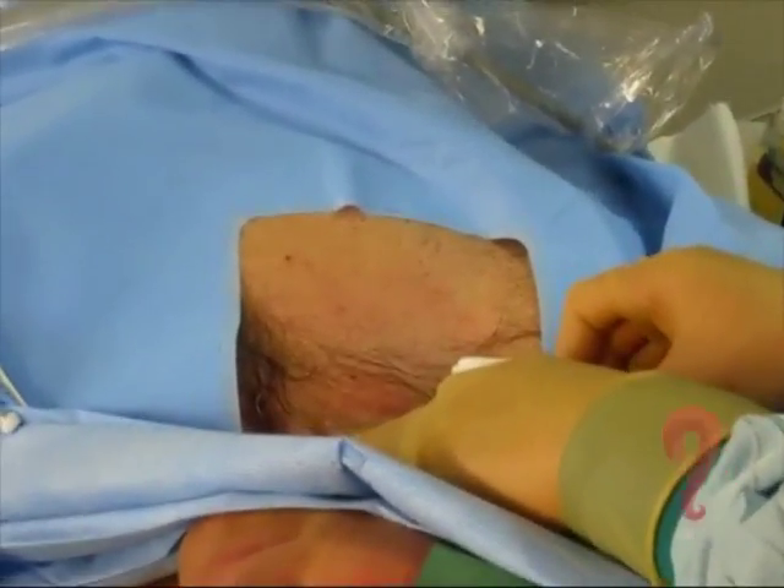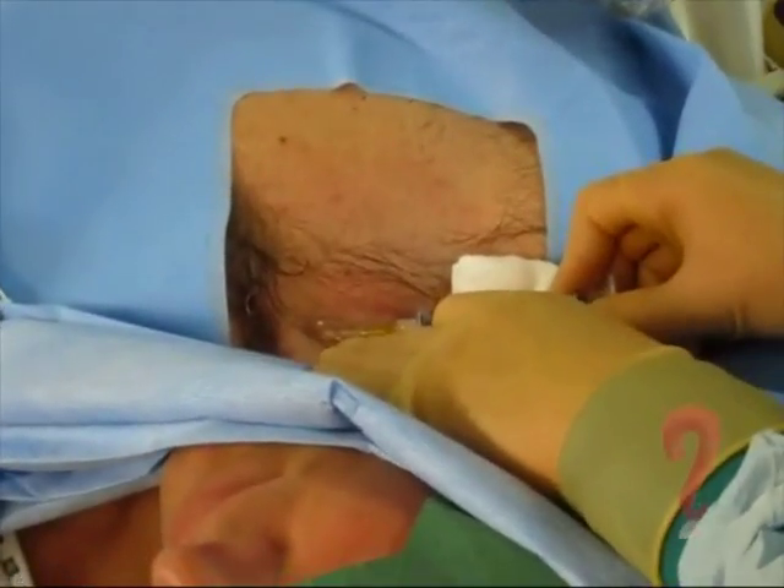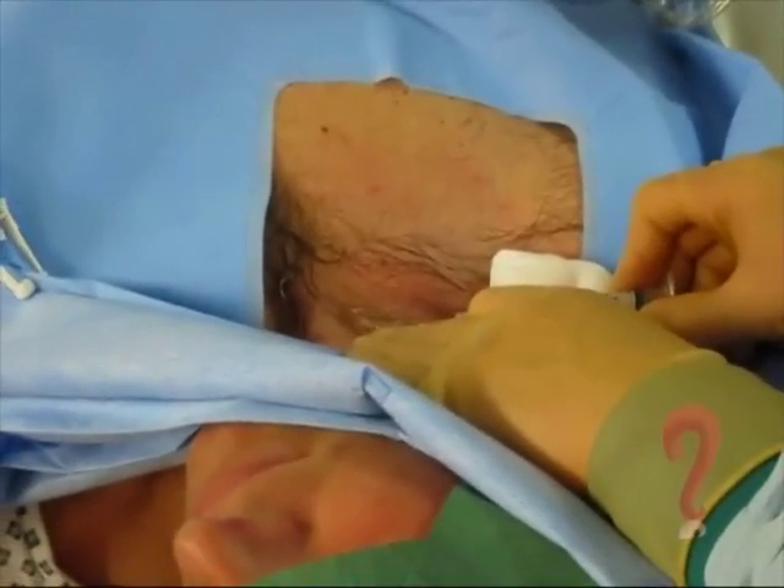We're using a low jugular approach to get as close down to the clavicle as possible, so the line doesn't ride up into the neck.